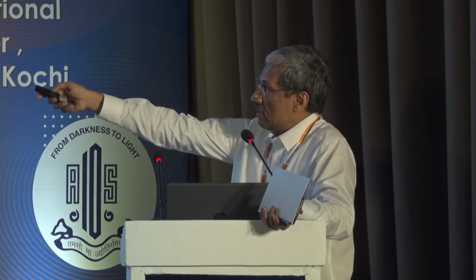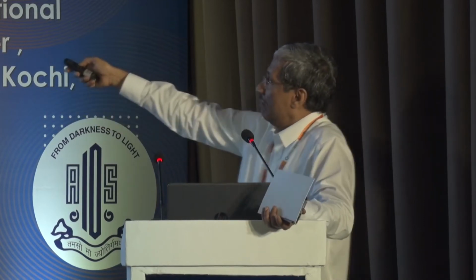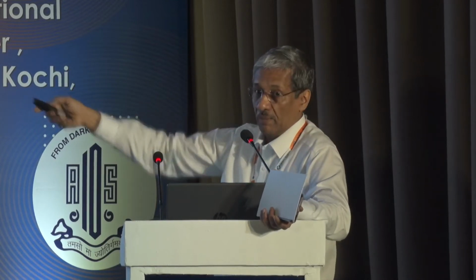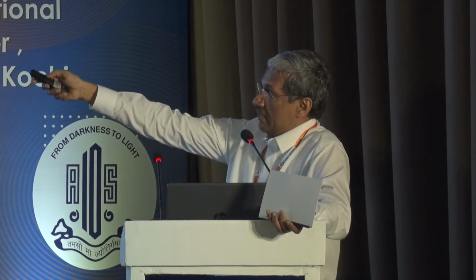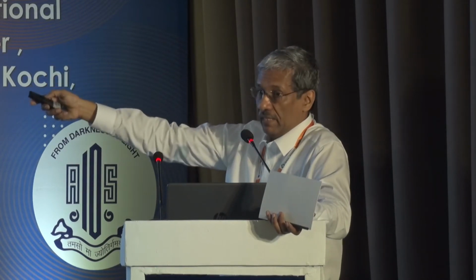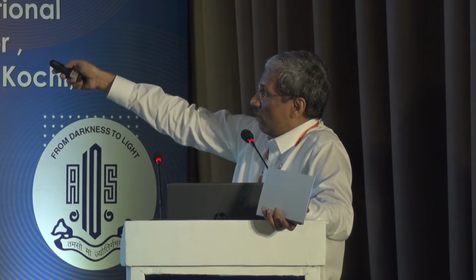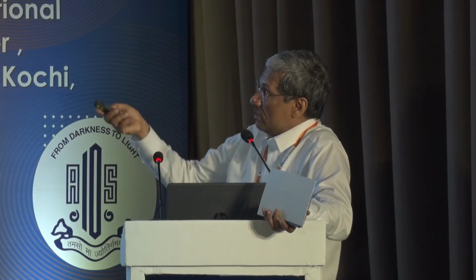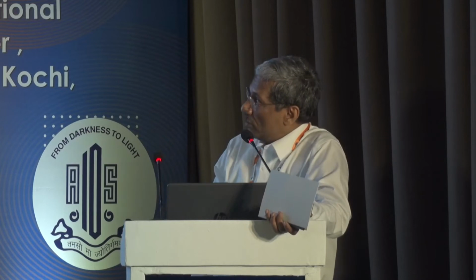Now, that's a central topo showing the lazy 8 kind of phenomenon, where you can see an enormous amount of inferior steepening. So it does identify abnormal corneas quite well. Here you can see on the left-hand side, it's not regular. Oblique astigmatism, inferior steepening. And you can see a nice cone forming up there in the Galilei G4. So if you use that central topo feature, you will identify the abnormal corneas.